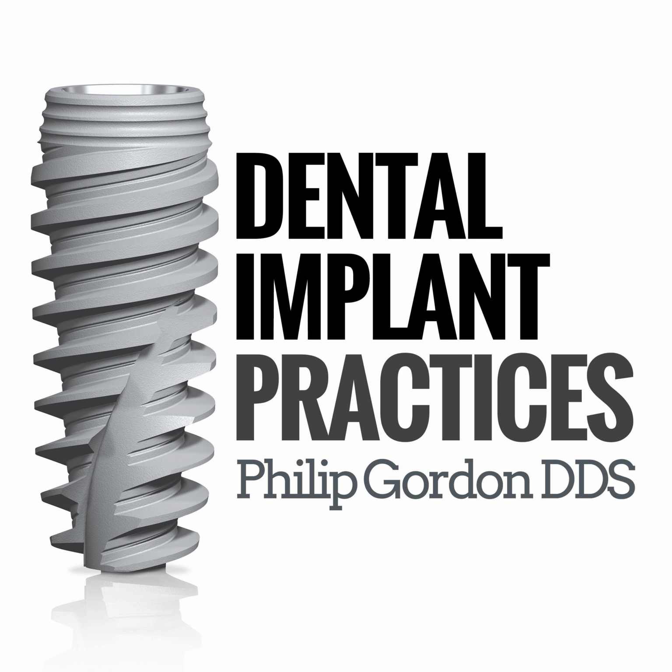When it comes to the maxilla, you can typically undersize one drill and torque it in because of the soft bone and achieve high primary stability. With the mandible, generally you're taking it to the final drill, and sometimes there is some self-tapping that needs to be done.